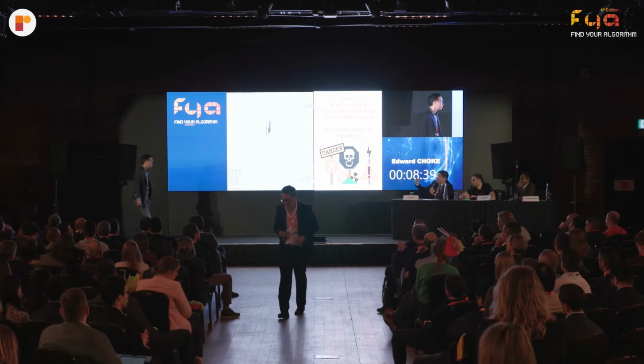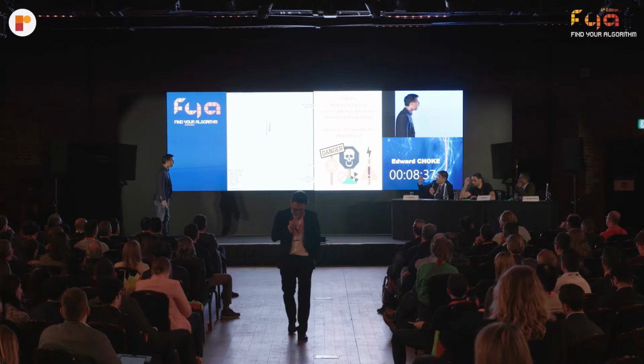Edward, however, I have to ask you something, because I have seen that Lorenzo has also shown in a previous presentation, not today, in another congress. Why puncture P3? Why not go further down and puncture, for example, a tibial artery? Why do this kind of retrograde puncture? You get more support. So frequently for extremely calcified SFA popliteal, I find that with the tibial, by the time I push up there, I can't get the wires to meet.